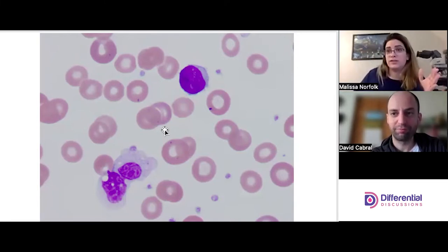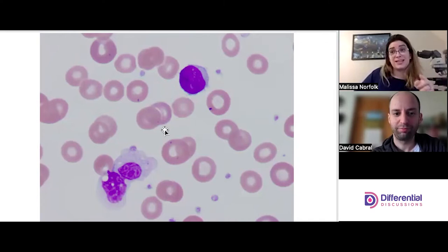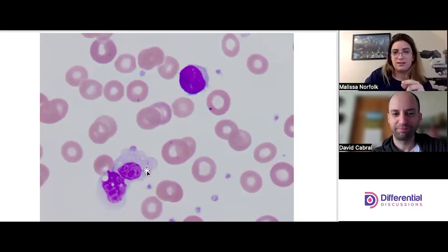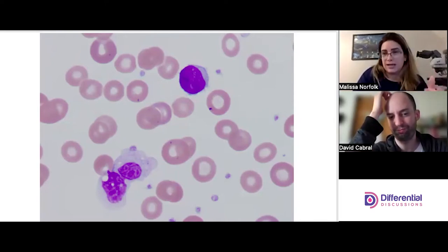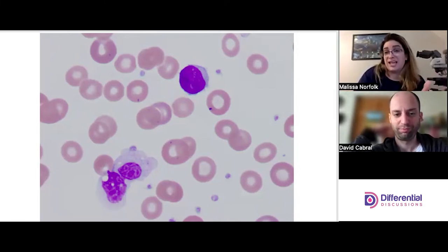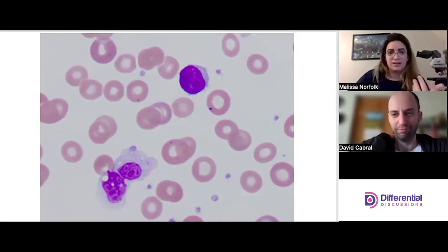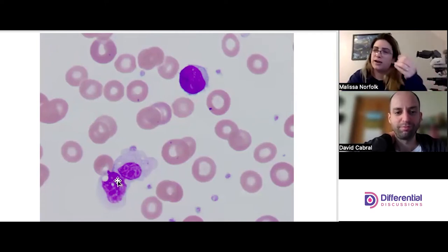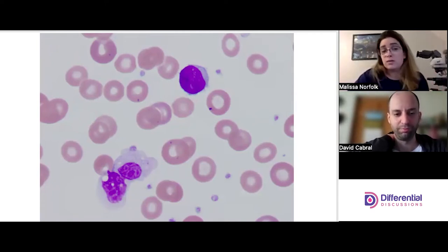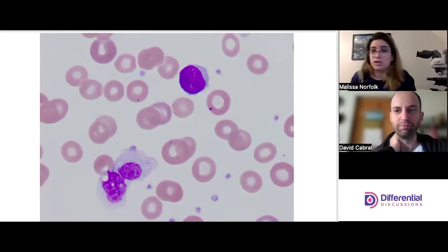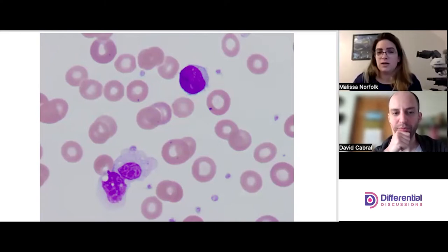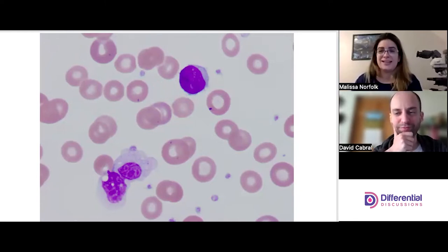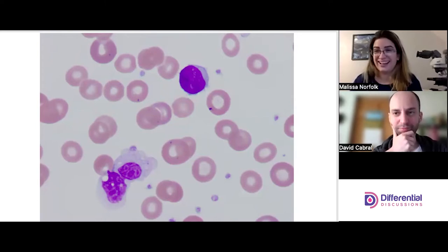If you look at the cytoplasm, it's not a pinky-purpley color — it's blue-gray and not granular the way neutrophils are. But this mono actually does have some granules, especially in this area. The textbooks describe it as a 'ground glass appearance' — I also like 'sandy,' it almost looks like you threw sand in there. The granulation is more fine. This is a nice example because it's a mono that's segmented and looks more neutrophilic because of the segments.